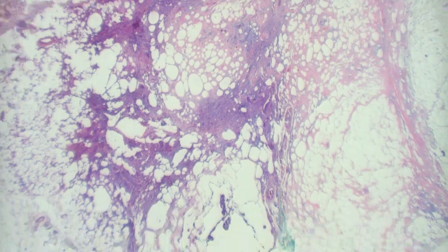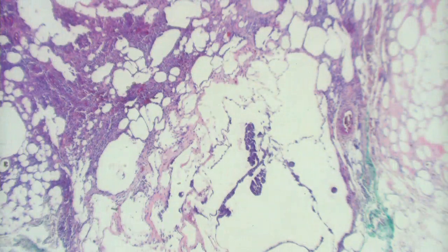But nevertheless, I think this was a spider bite in this case, with all this suppuration and secondary necrosis and degeneration of collagen. So this is not like a mosquito bite or an ant sting. This is a pretty nasty looking situation here. Suppuration, fat degeneration, a lot of that is probably secondary. In other words, the spider kills your fat and then the secondary inflammation comes in.